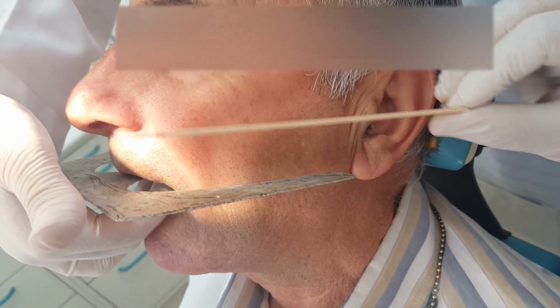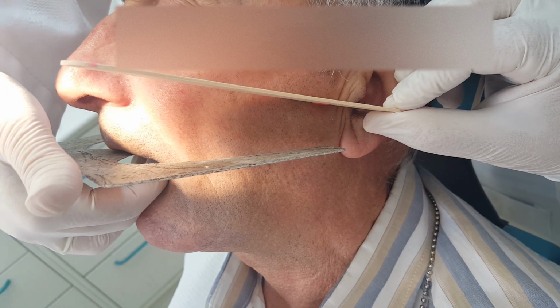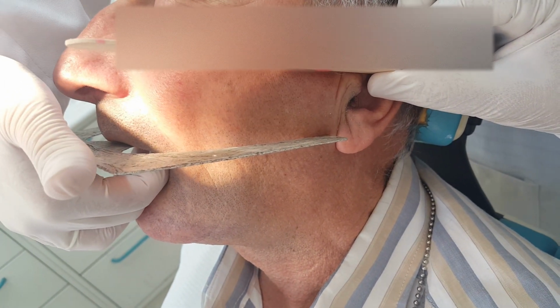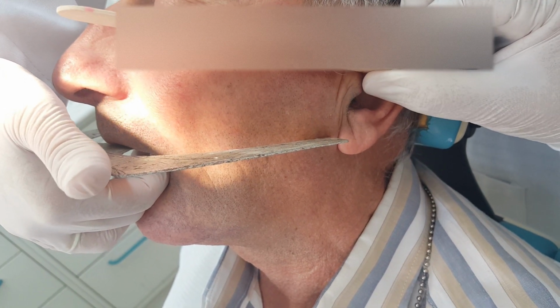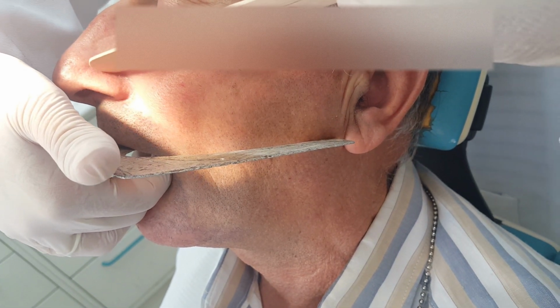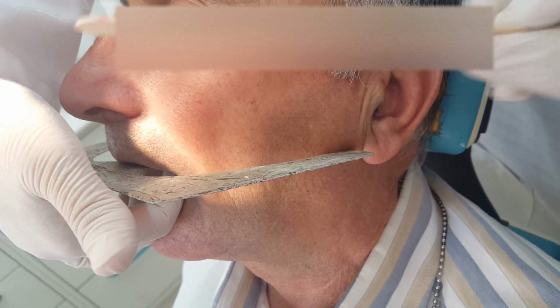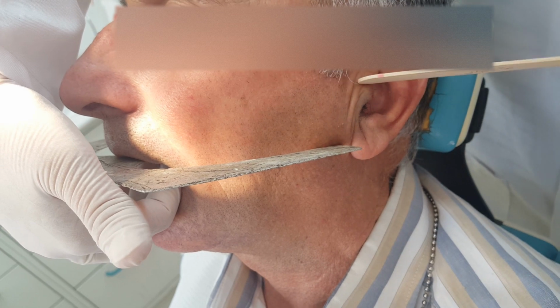Now, in books, you will find that sometimes they say middle of the tragus and lower of the tragus. And in some books, they talk about the upper of the tragus. Which one do we use? Well, I'm going to tell you that the books that talk about the upper tragus, they also concentrate on the upper of the ala. At the same time you're looking at the plane here and here on the upper. So upper with upper, okay?